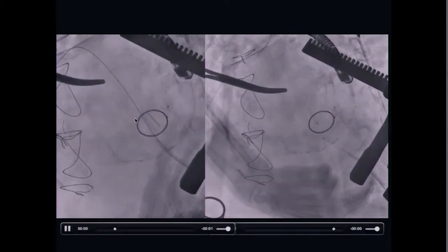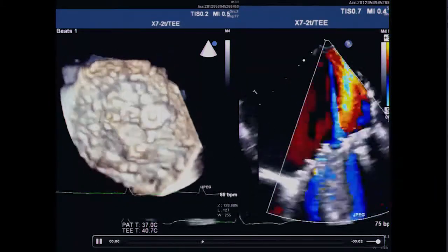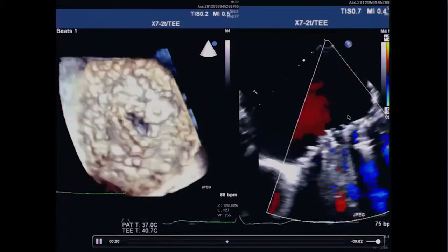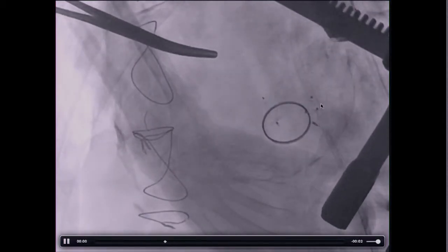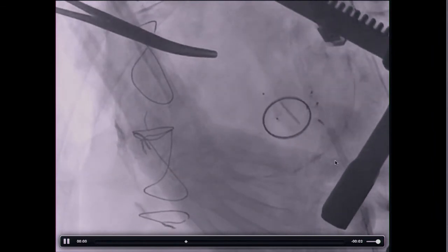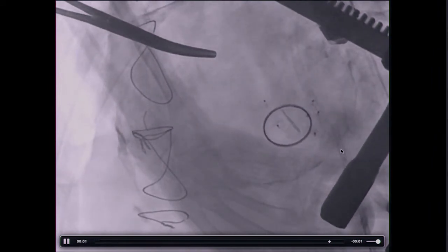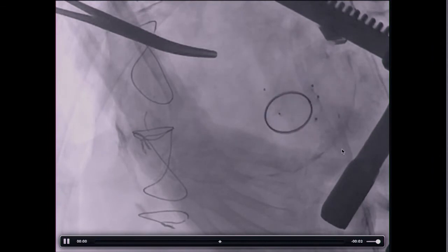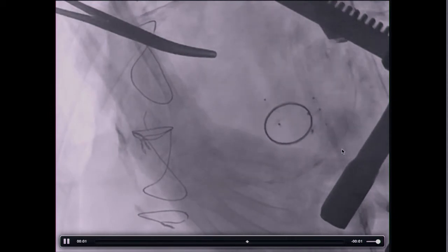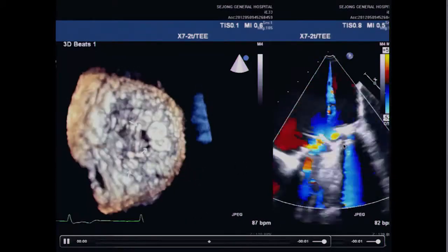On the medial side there was another defect, which I closed with a plug. However, there was still a remaining paravalvular leak on the lateral side, so I put another vascular plug there. Through the apical approach we can address so many paravalvular leaks very easily. However, this requires thoracotomy. If I use the echo navigator, I can puncture the proper site and may select this paravalvular leak more easily. After device closure, there was no paravalvular leak at all.